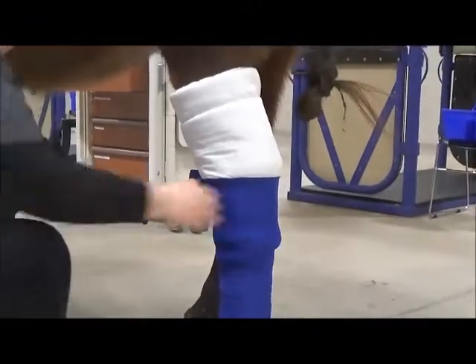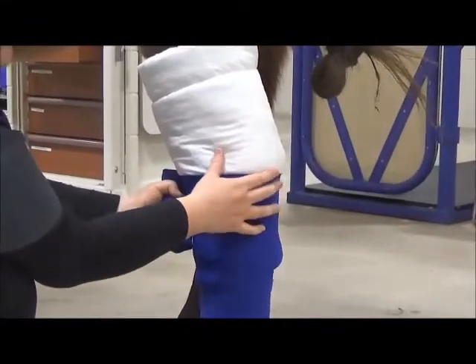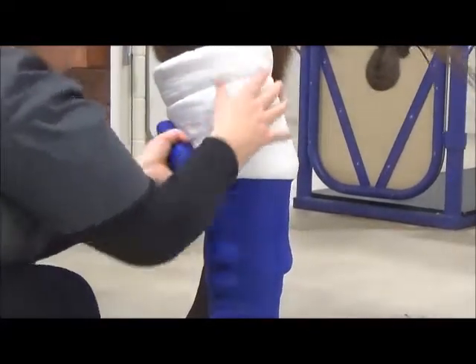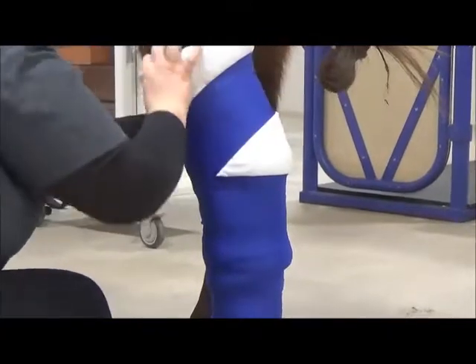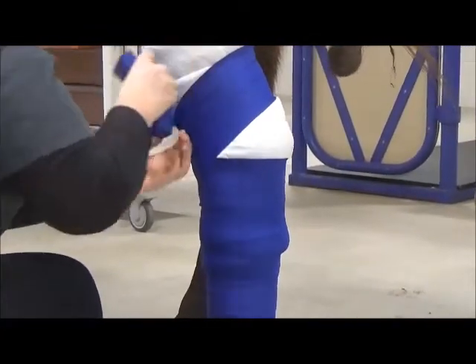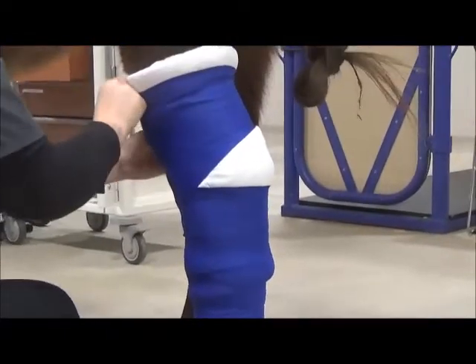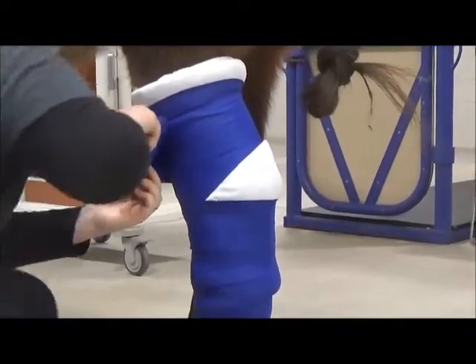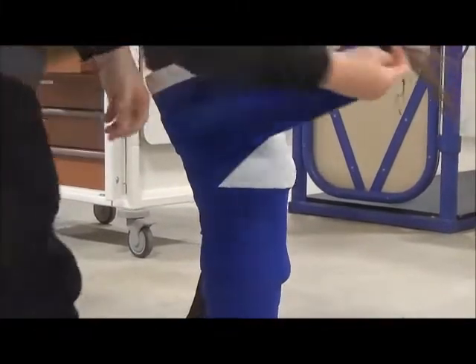And then at this point, so this is the point of her hock, I want to leave a gap in the padding right here so that she can still flex her hock a little bit. So I'm going to do a big swipe up. And then I don't have enough wrap to do more than this, so I'm going to do one swipe around. And then I'll use one more blue bandage to finish the wrap.